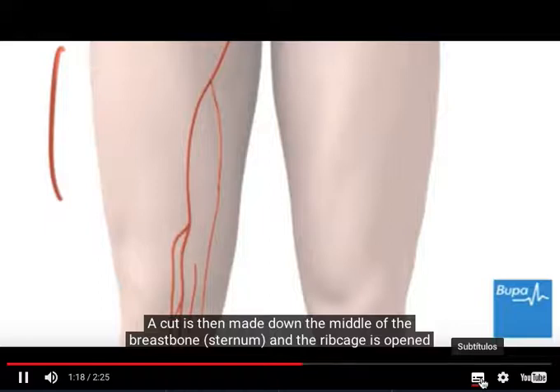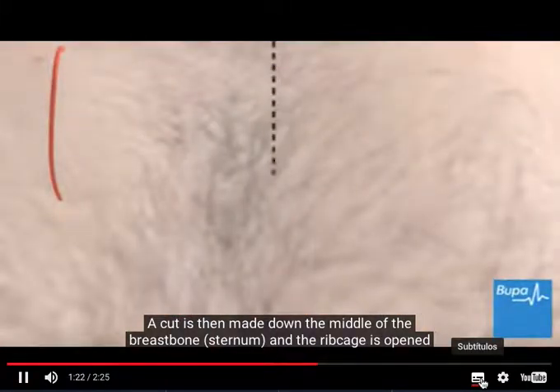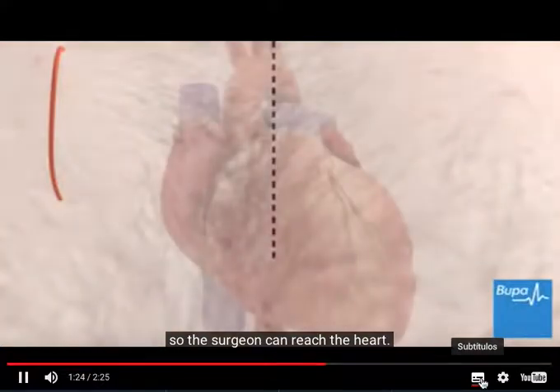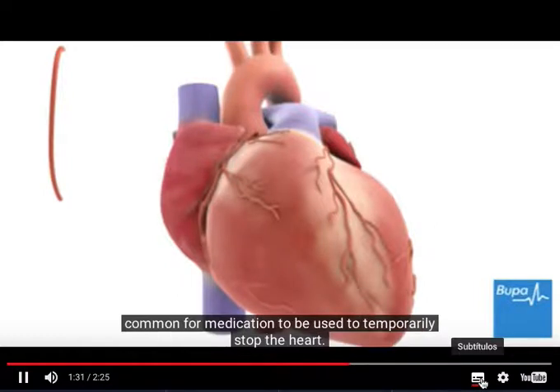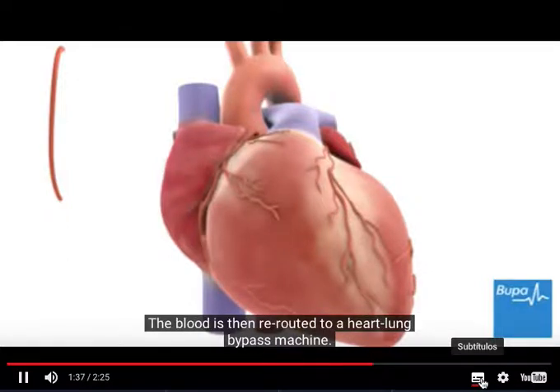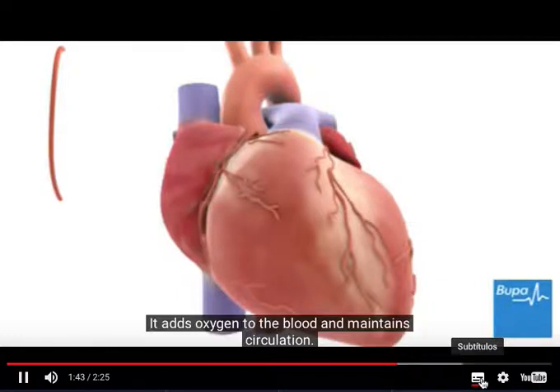A cut is then made down the middle of the breastbone, or sternum, and the rib cage is opened so the surgeon can reach the heart. The surgeon may attach the new grafts while the heart is still beating, but it's more common for medication to be used to temporarily stop the heart. The blood is then rerouted to a heart-lung bypass machine. This takes over from the heart and lungs, adds oxygen to the blood, and maintains circulation.